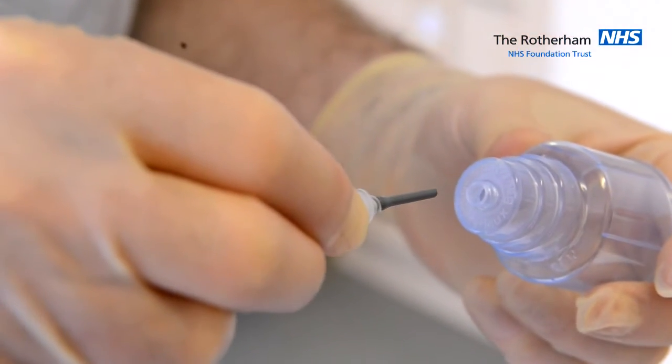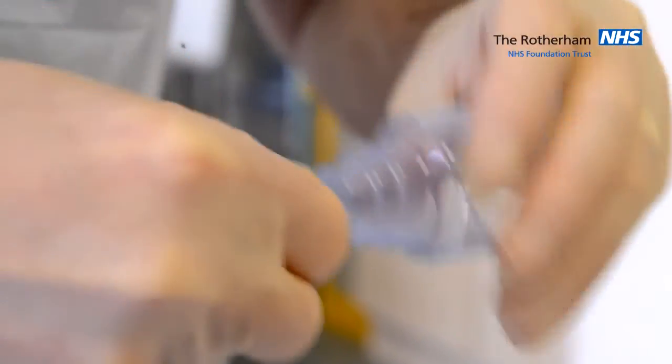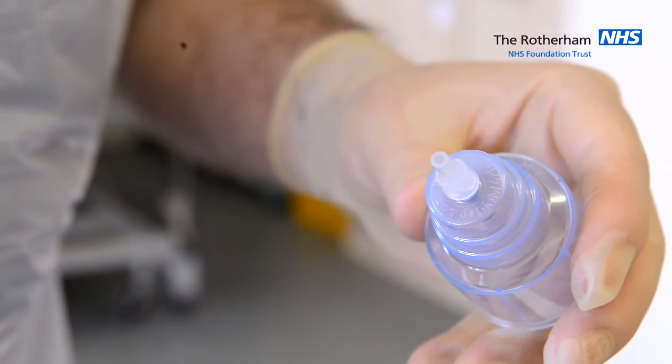Attach the butterfly and the adapter together. Remove the butterfly to leave the adapter in place. Do not contaminate the adapter.